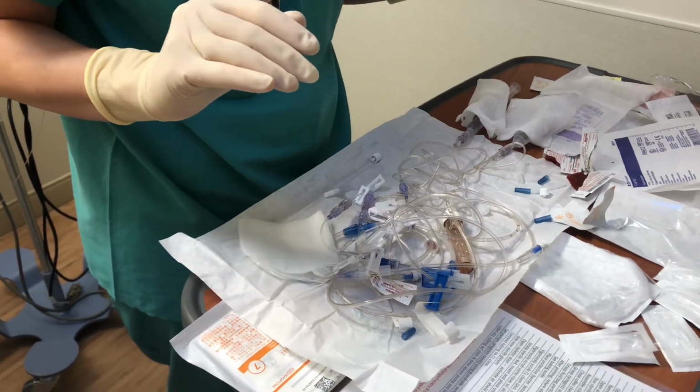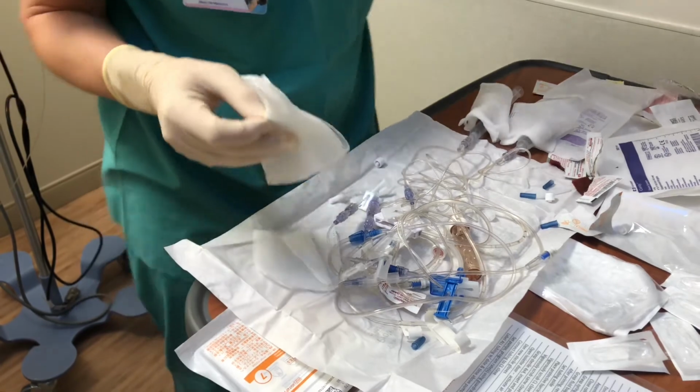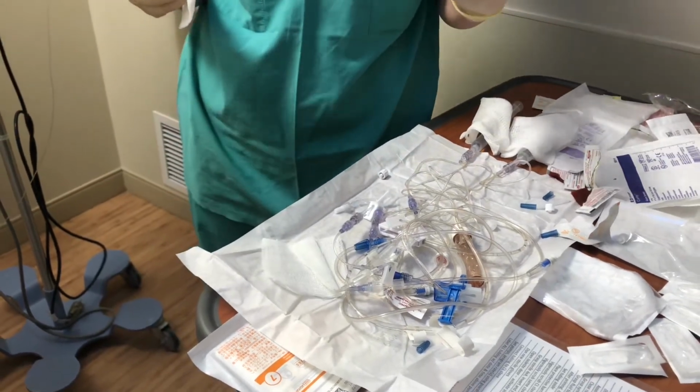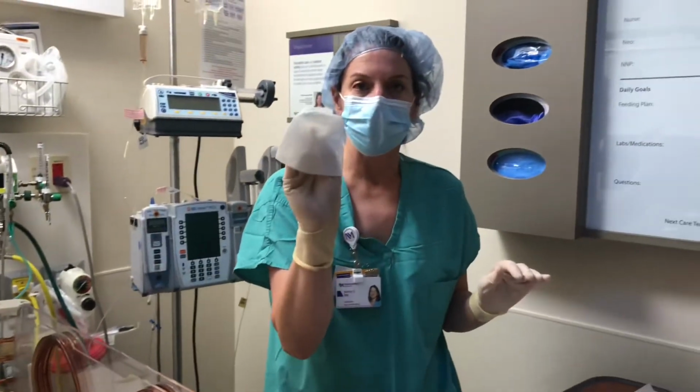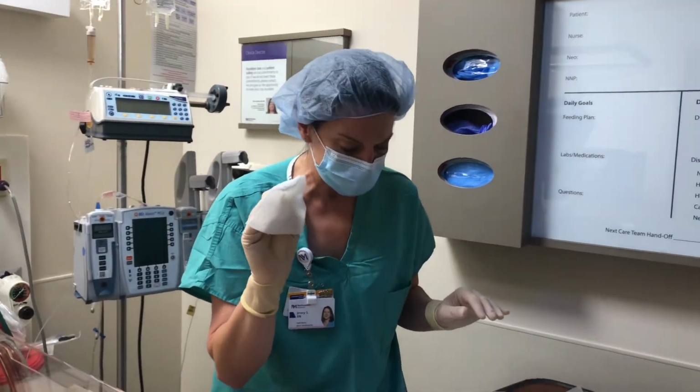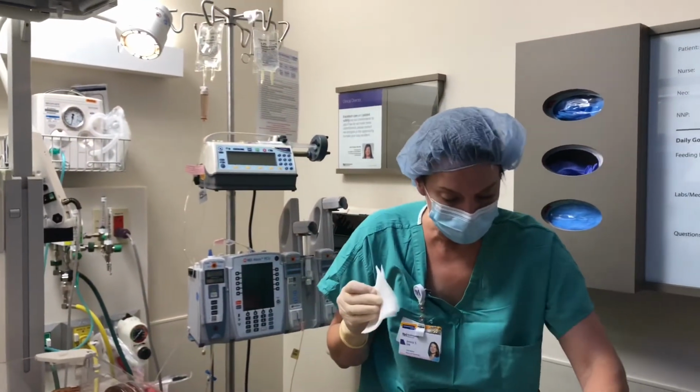and we're going to now spike our IV fluid tubing, or your TPN, with the bag. So we're going to take another one of these sterile 4x4s, which is going to allow me to grasp the bag, and then I'm going to spike that.